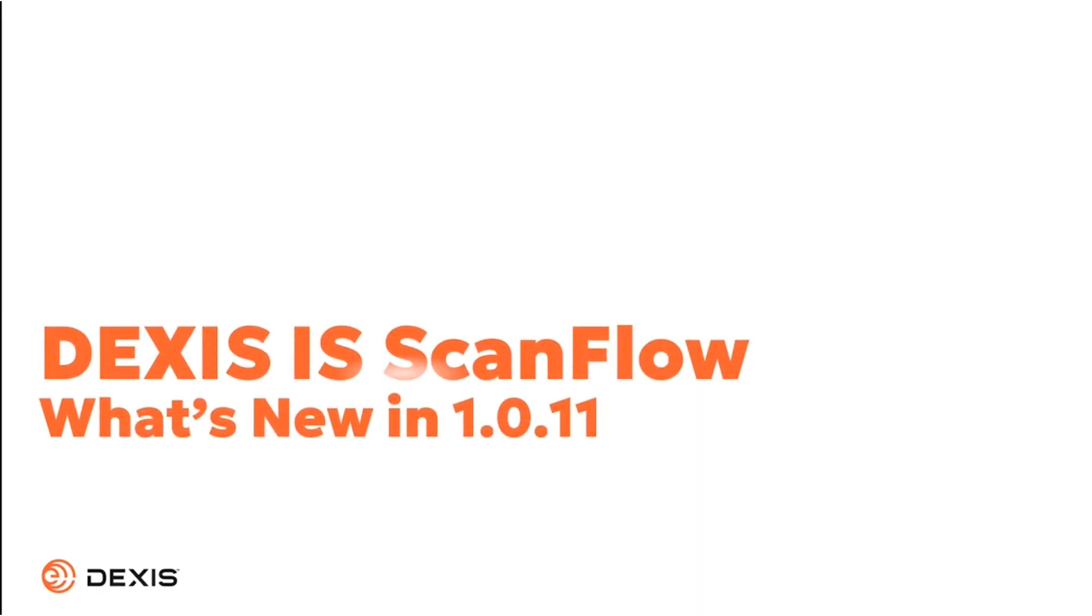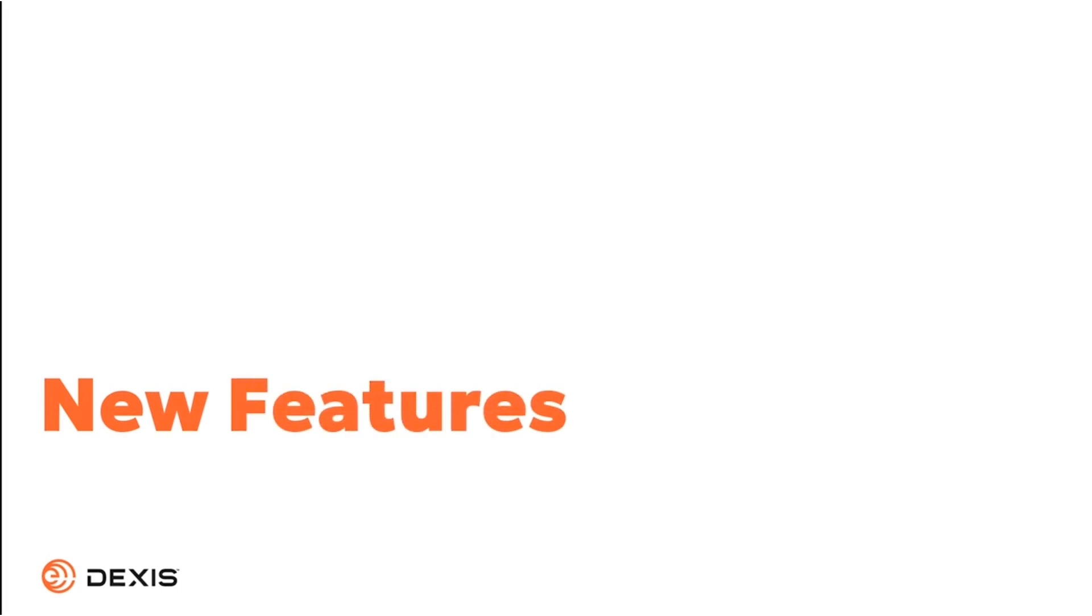Welcome to Dexis IS ScanFlow, what's new in 1.0.11. Dexis IOS Solutions is introducing the latest release of Dexis IS ScanFlow, which brings new features to our scanning software and includes the following enhancements.